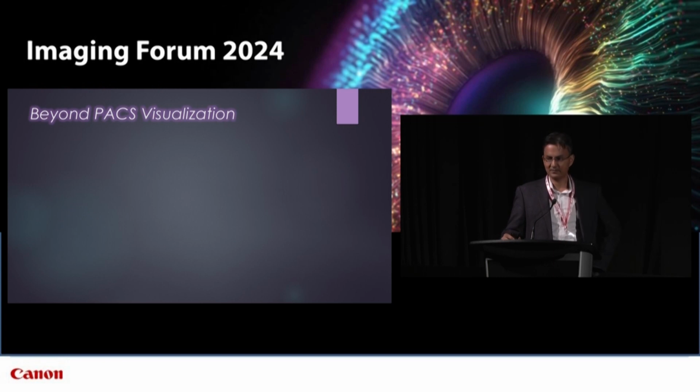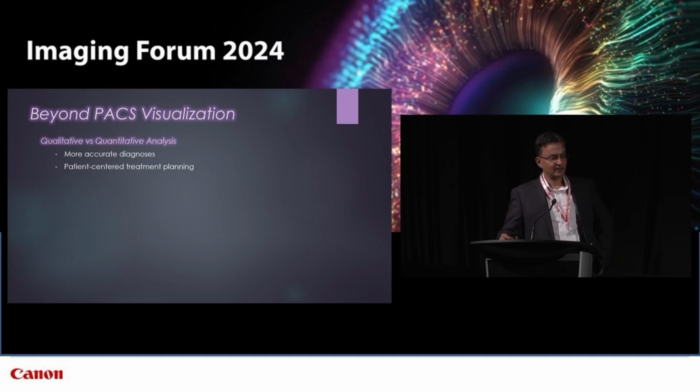We know there's a rich amount of data in what we can do with that data, and we've seen lots of examples of what we can do. But day-to-day, regular clinical work is still largely in the 2D realm, and it's a lot of axial scrolling. That being said, what we are doing routinely happens to be qualitative, but there's been a gradual push to do more and more quantitative analysis by radiologists. And that really does translate to more accurate diagnoses and treatment planning.